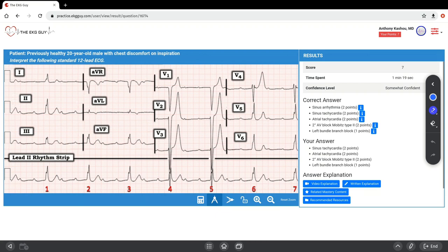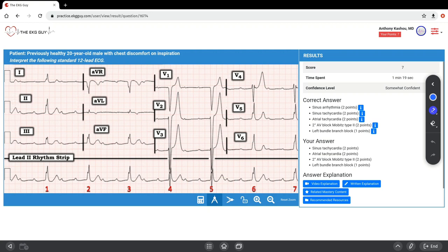The discordant STT changes, meaning opposite to the main QRS deflection in the right precordial leads V1 to V3, are within normal limits of the expected findings in left bundle branch block. However, if you had concordant changes or changes out of proportion to the discordance, this could suggest underlying pathologies such as ischemia.